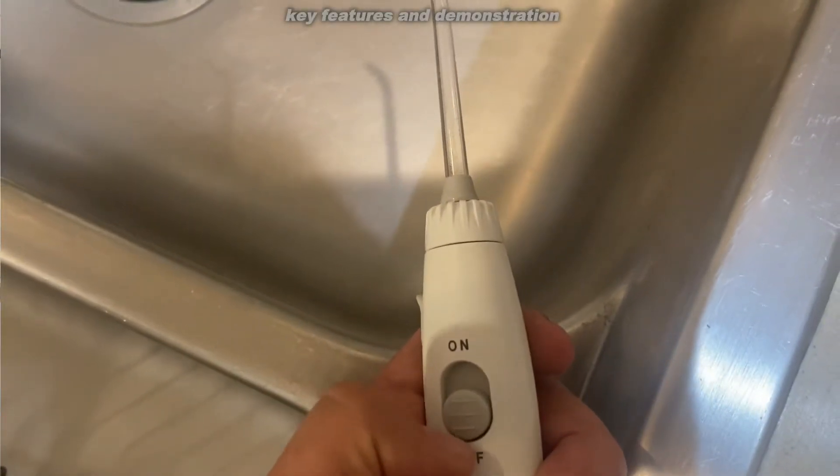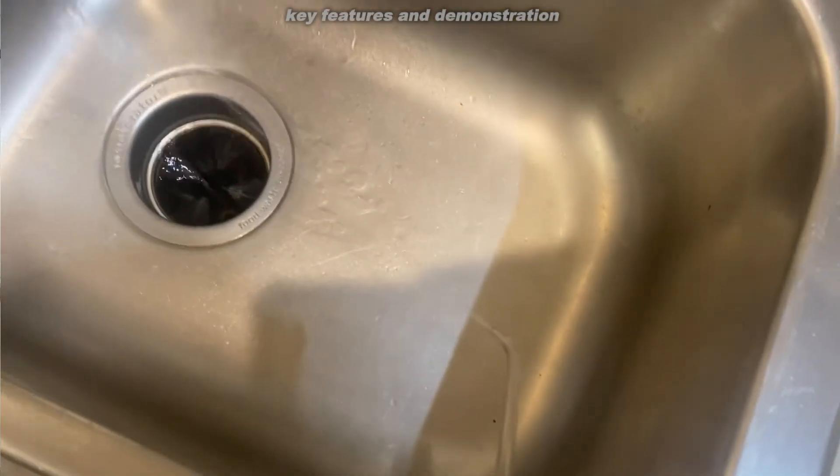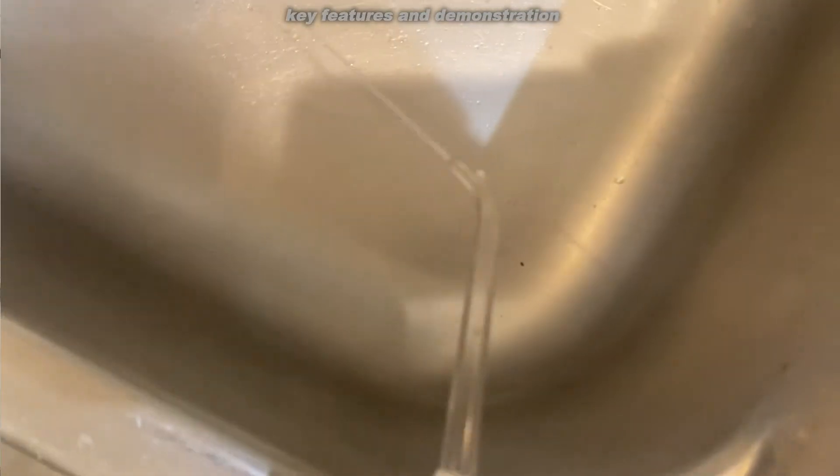Alright folks, let me step away from using the water flosser so I can tell you a little bit about it, so you know if you want to buy it — which honestly I think you should. Personally, I like to floss my teeth a lot. I floss at least twice a day. I'm very happy when I go to the dentist and they tell me I don't have much in the way of anything they need to do in their cleaning — no cavities and my teeth looking good. One of the reasons I'm able to do that is because I have a very good water flosser.